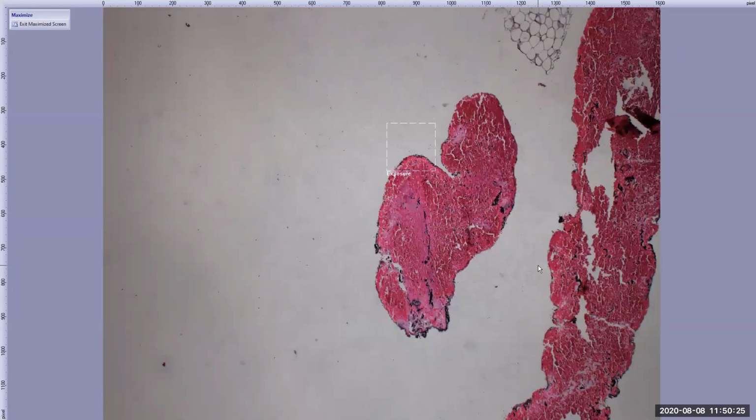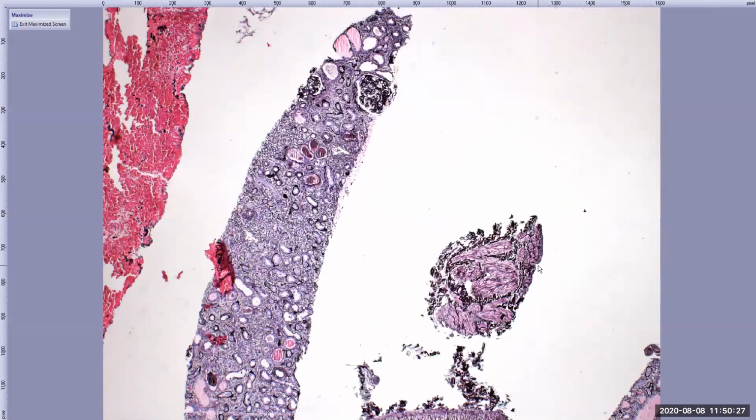Shree, we have a question from Manisha. The protein kind of looks like the fractured cast that we described for myeloma cast nephropathy. So how do you tell the difference?